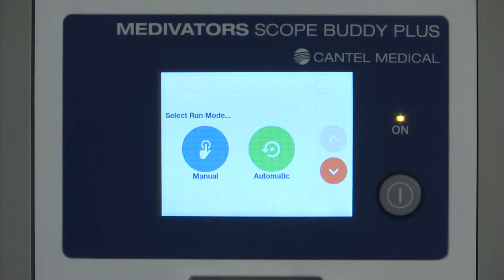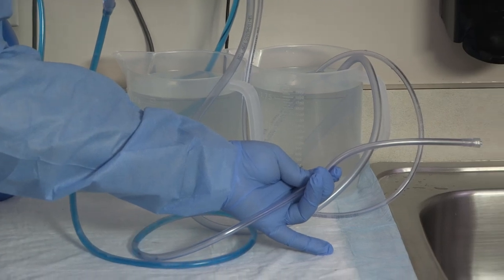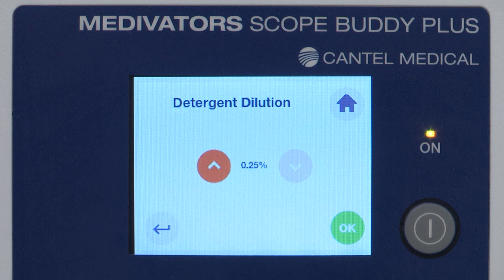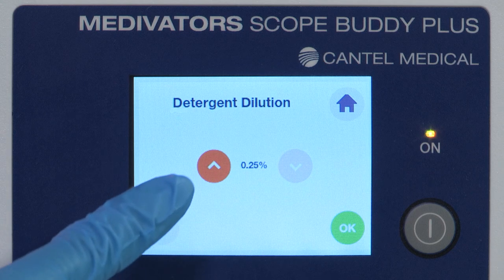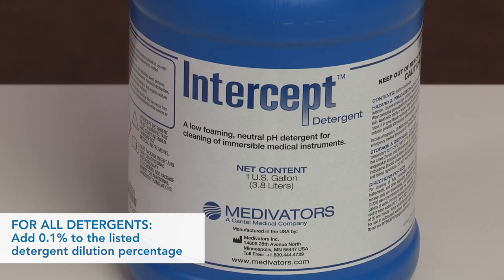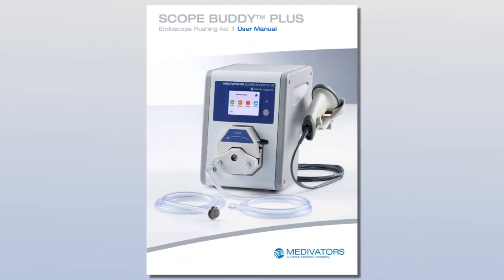The detergent in-tube will need to be primed after completing first-time setup. Priming is necessary to ensure correct detergent dosage. The detergent dilution screen allows input of the recommended dilution percentage to provide correct detergent concentration. For Intercept Detergent, use 0.35% detergent dilution. Press the up and down arrows to adjust the percentage, and press OK when 0.35% is displayed. To accommodate variance in the unit, 0.1% should be added to the listed detergent dilution for all detergents. Refer to the user manual for assistance on correct detergent concentration.